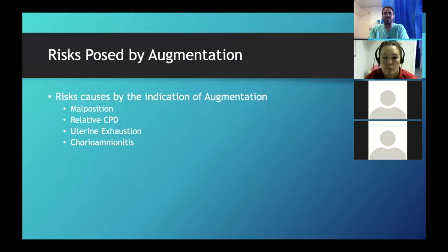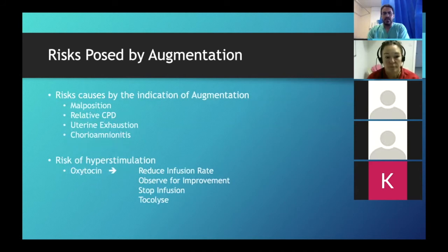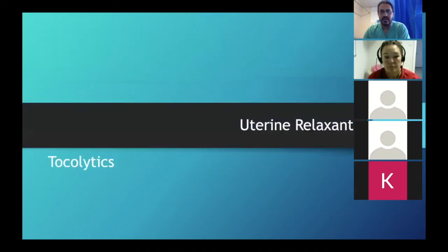Okay. From the baby's point of view, remember that this baby has been under oxytocin for the last 12, 14, 15 hours. Be very, very mindful of what's going to be happening with this baby's heart rate. Keep a very close eye, because this placenta probably doesn't have a lot of reserve now that it's been working for the last 12 hours. And always be very mindful of hyperstimulation.